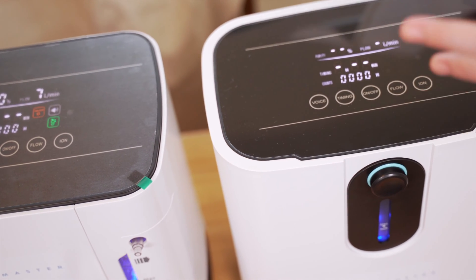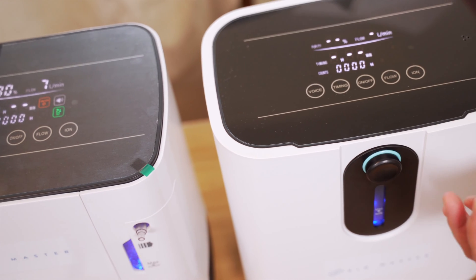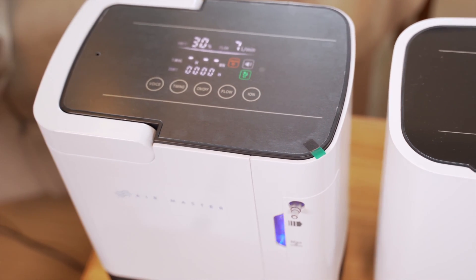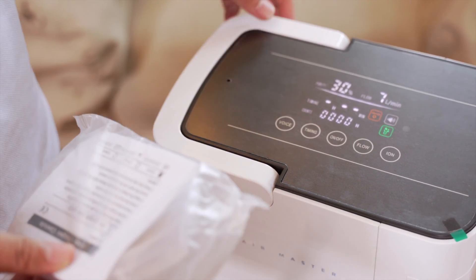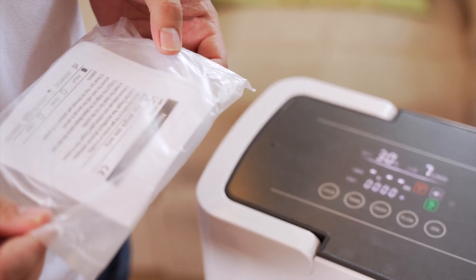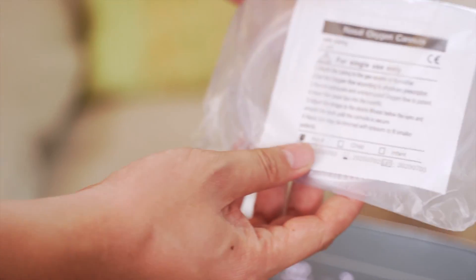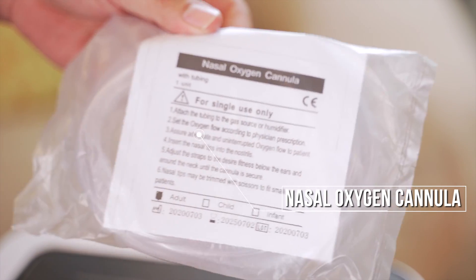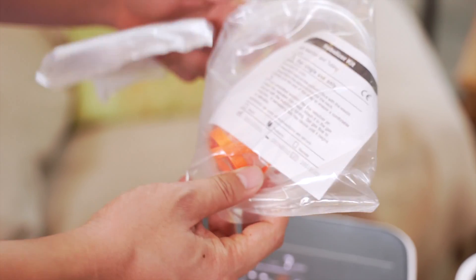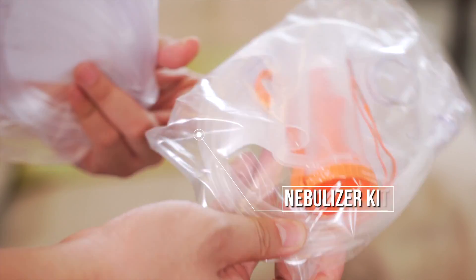Practically, it really concentrates the 21% oxygen and brings it up to about 95% oxygen. Now let's do a demonstration. This oxygen concentrator comes with a 2-meter nasal oxygen cannula. It also comes with a nebulizer kit, so you can also use this as a nebulizer.